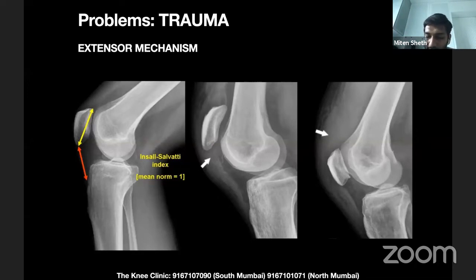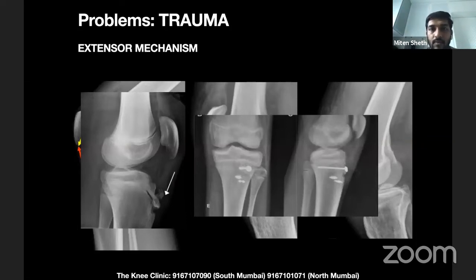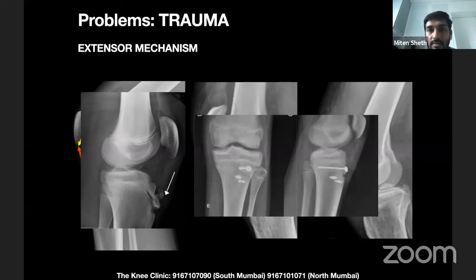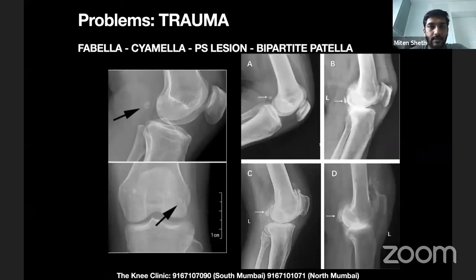In adolescents, if a 13-year-old football player with known Osgood-Schlatter's has a sudden eccentric quadriceps contraction, the fragmented tibial tuberosity can avulse completely. On X-ray, without annotating the arrow, you might read it as a normal Osgood-Schlatter's X-ray, but this is actually an avulsion associated with point tenderness — it needs to be picked up and fixed.